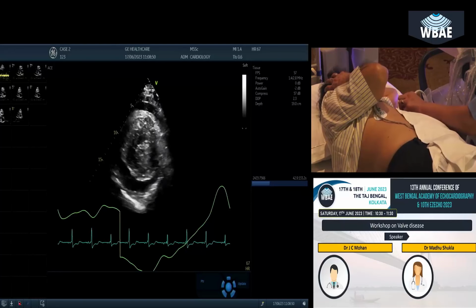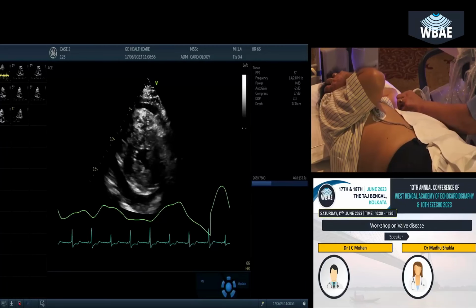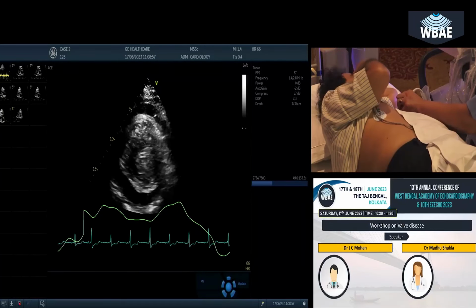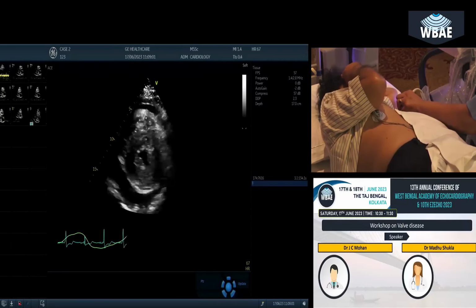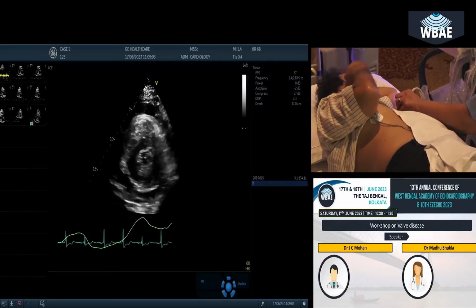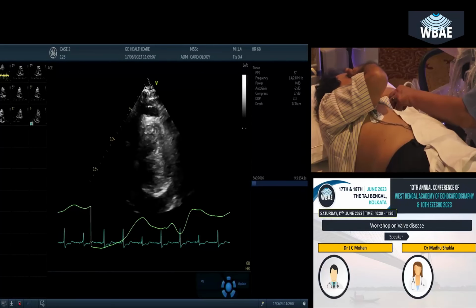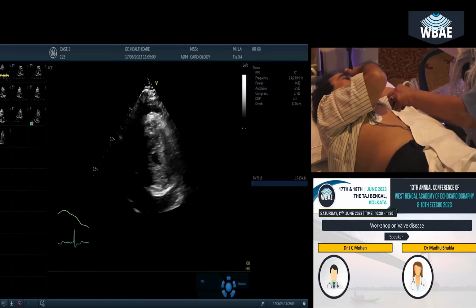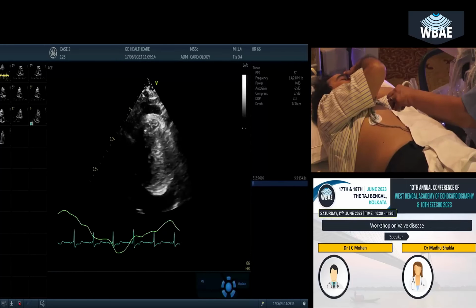Slight anterior displacement. So this is nearly at 1 o'clock position. The anterolateral papillary muscle is at 1 o'clock position. So there is a displacement, but we don't see any crypt so far. And go to the apex, please. Yeah, that is all. At the apex you really see it completely squeezed out, and you don't see much of the right ventricle. So that's all right.